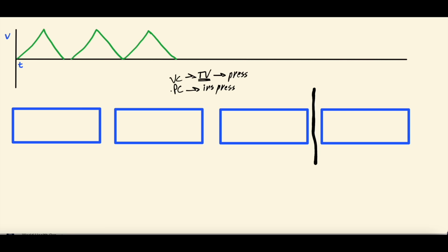In pressure control, you're controlling the pressure. You're saying, hey, ventilator, with each breath, I want you to give a set pressure. What is uncontrolled, though, is then the tidal volume, and we'll put uncontrolled for these, because that's the uncontrolled variable that results from the pressure you set.